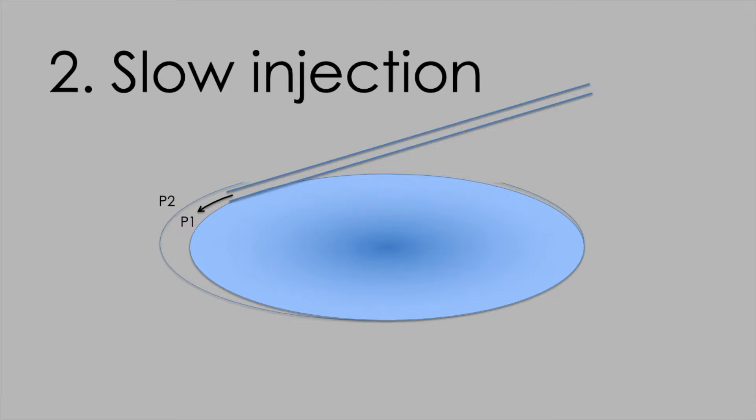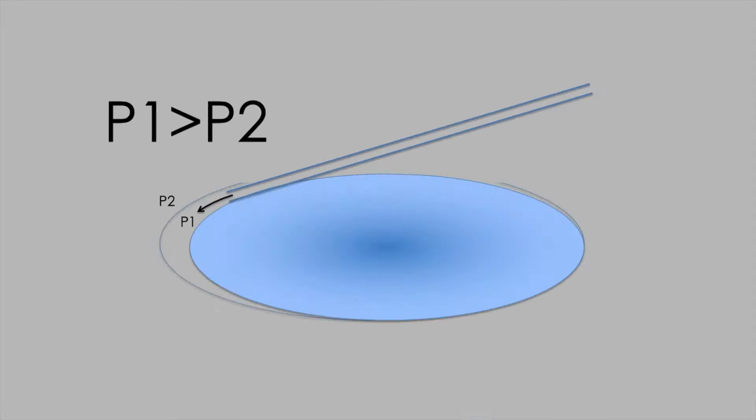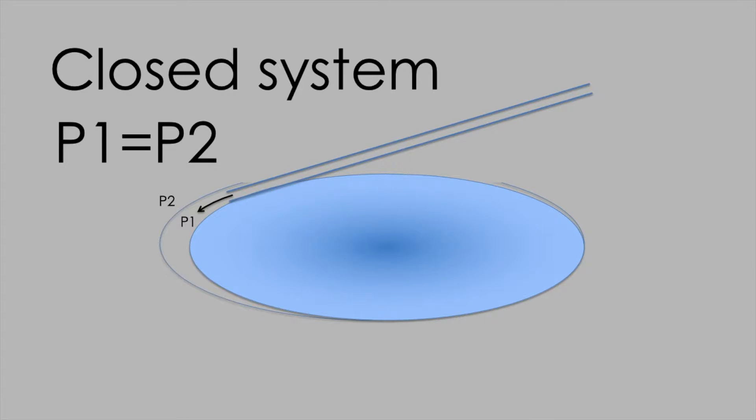We're then ready to commence the slow injection phase of hydrodissection, and the purpose of slow injection is to promote free flow. Why is this important? Well, to make hydrodissection work you have to localize pressure differential between the inside and the outside of the capsular bag. If you have the viscoelastic blocking the entry site around the hydrodissection cannula and you've got a closed space, the pressure throughout that volume will be uniform. All you're going to achieve by injecting rapidly ab initio in hydrodissection is raised pressure in the anterior chamber. That's uncomfortable for the patient and it doesn't achieve anything.